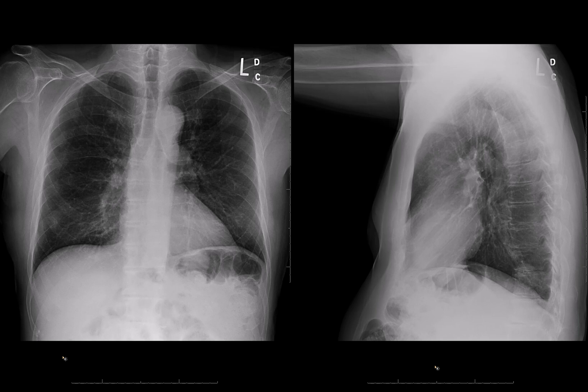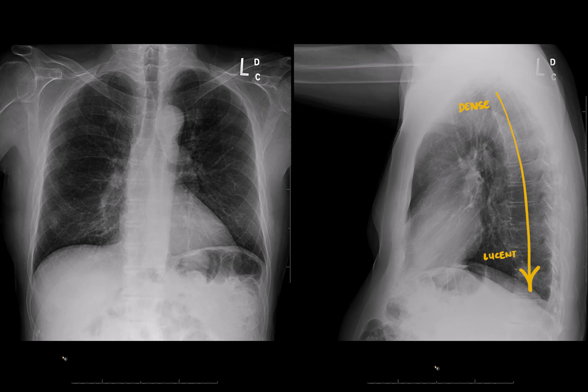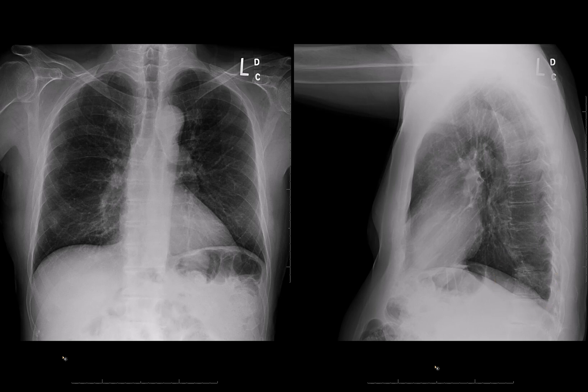On the lateral view, there's another sign called the spine sign. As your eye moves from superior to inferior over the spine, it should go from more dense to less dense. That's because the relative amount of soft tissue compared to lung is greater in the upper chest compared to the lower chest. But if you have disruption of that gradient — if you have a density where it should become more lucent — that should make you think that there's an abnormality in the lung or possibly in the pleura or spine itself. In the case of a lung density, it could be a consolidation like pneumonia, or it could be more round like in this case.